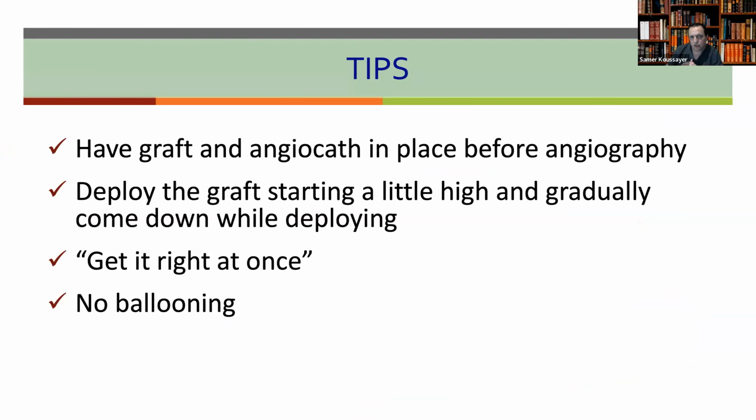And the most important, no ballooning. We don't balloon when you have a clot, unless you have a type 1 endoleak, then you have to be very careful, very gentle with ballooning. On our EVARs, all of them we do prophylactic ballooning, except when you have a clot. I don't do ballooning unless it's a type 1 endoleak.